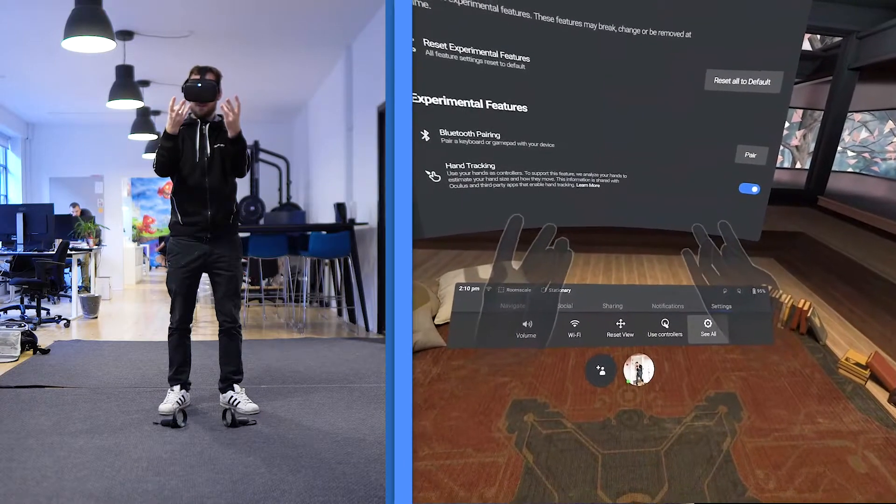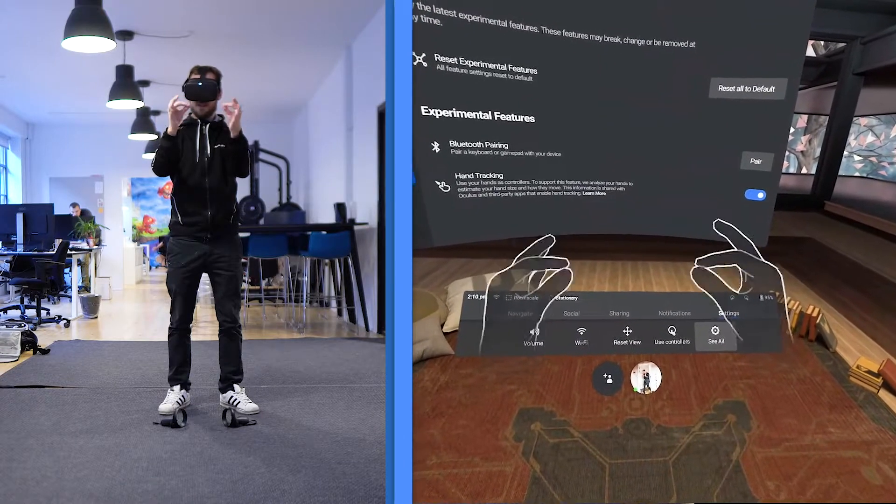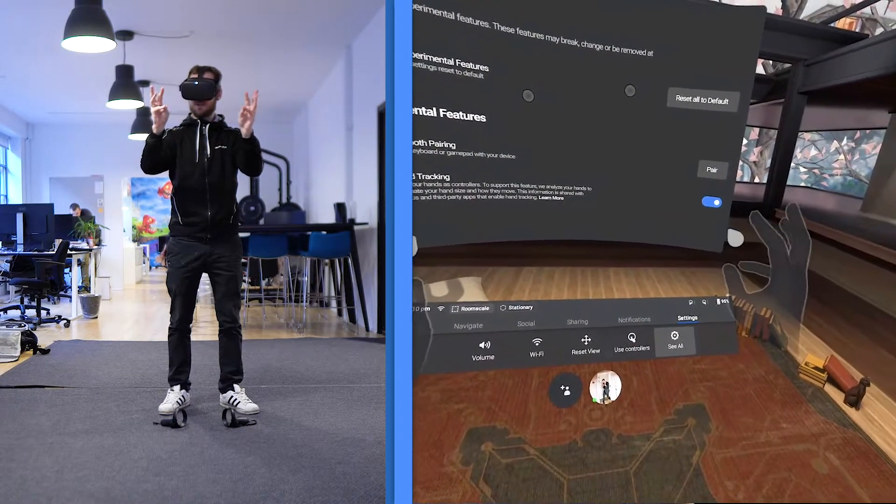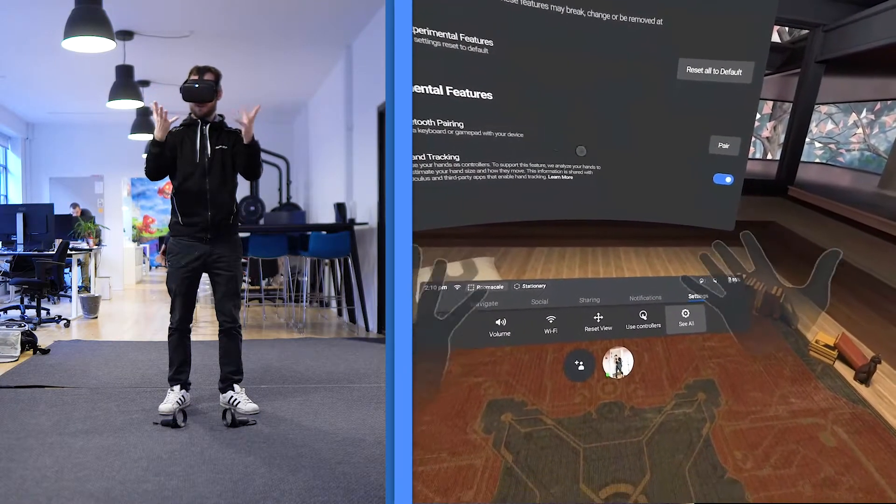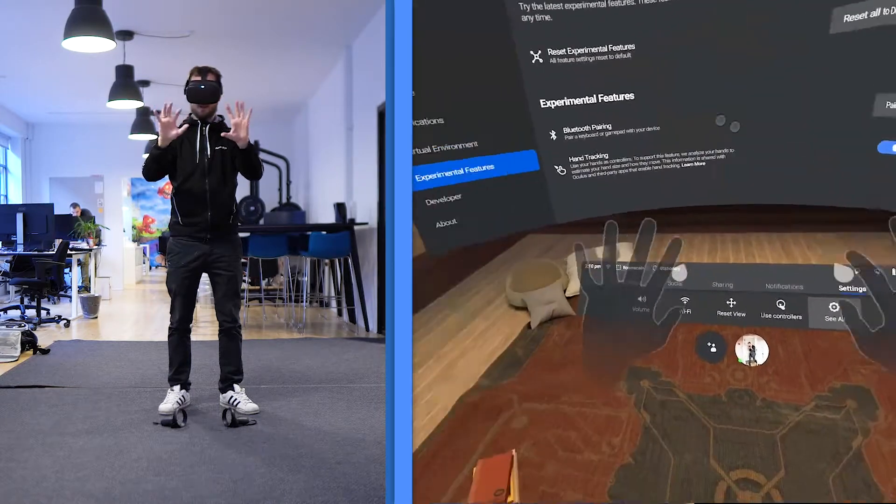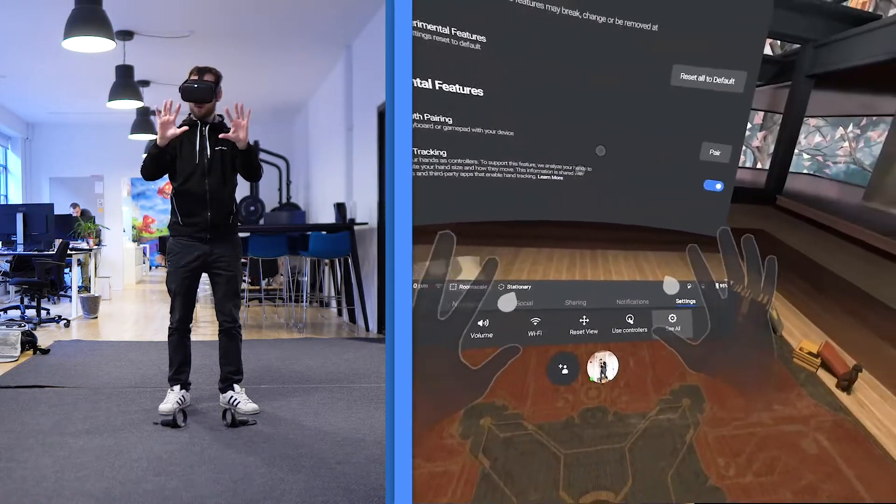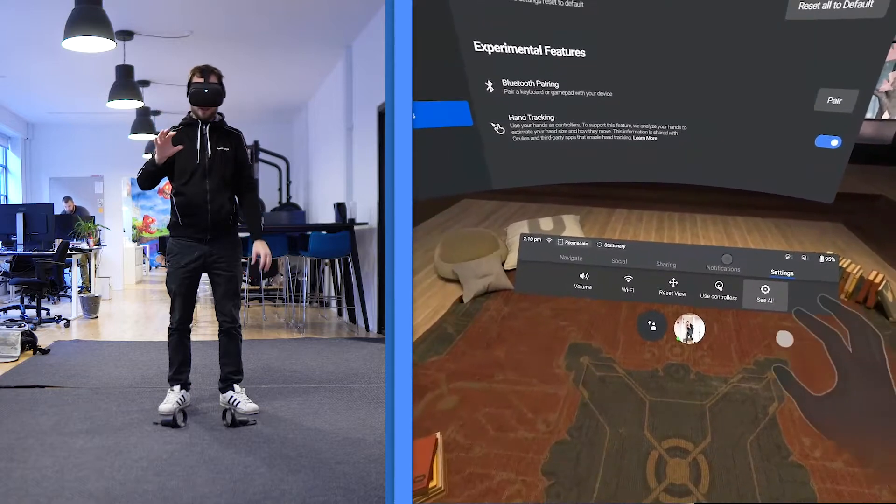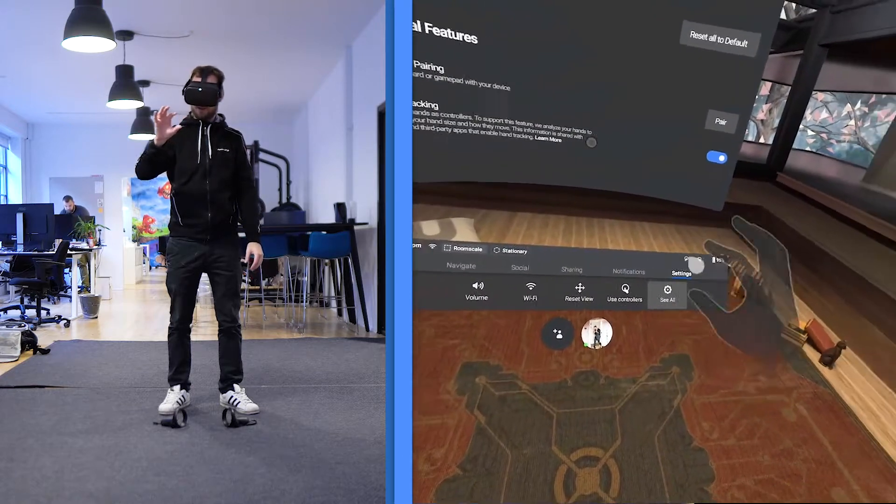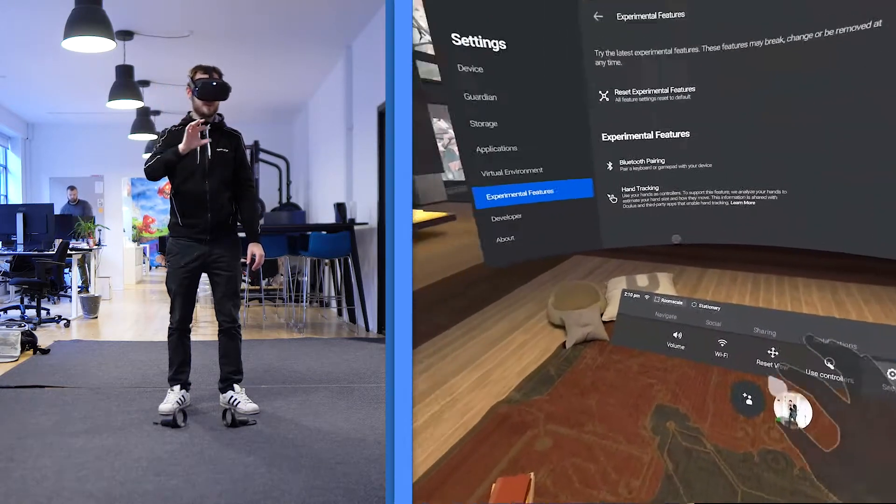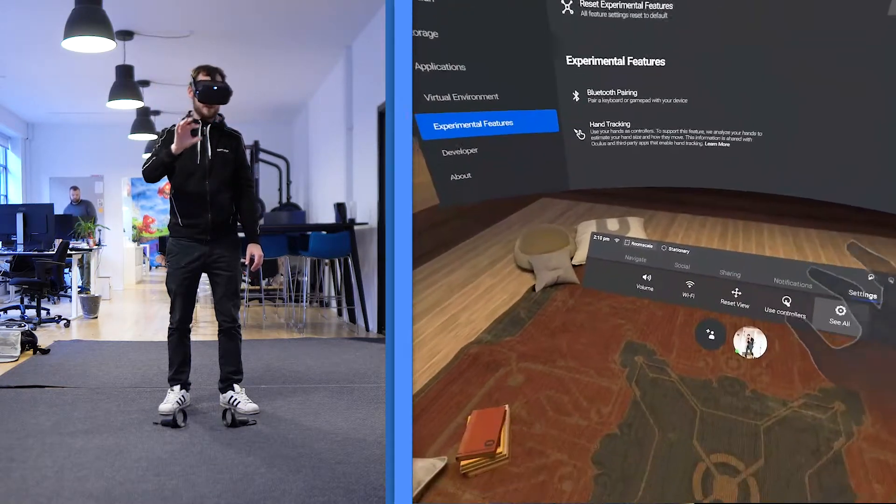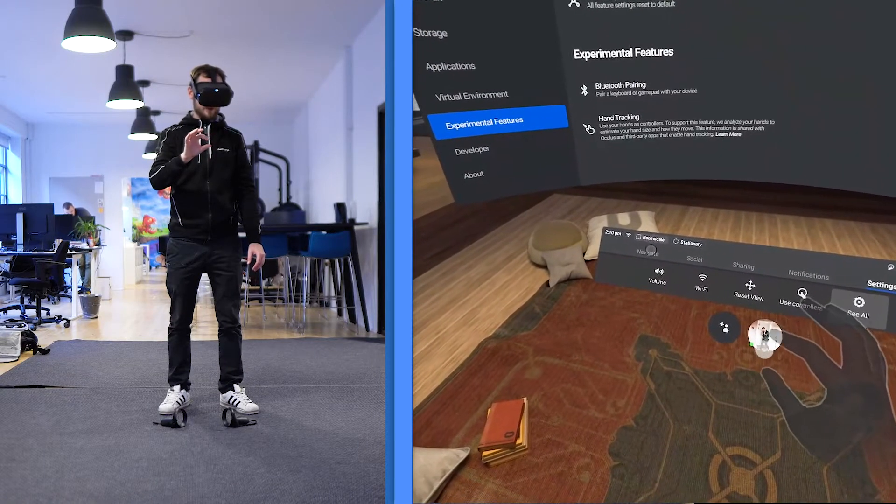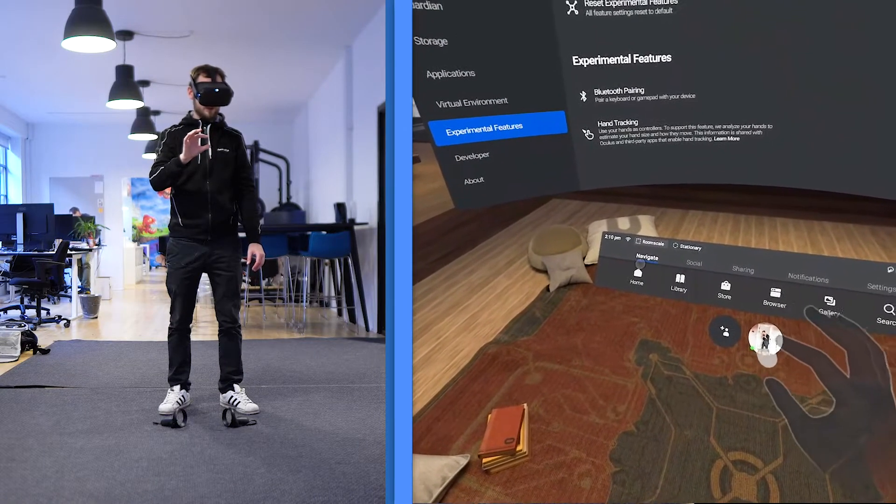But I mean, besides that you have very precise mapping of the hands and there's basically no delay and how you work it is you point. You can see there's a pointer here. So you point where you want to go and you pinch.